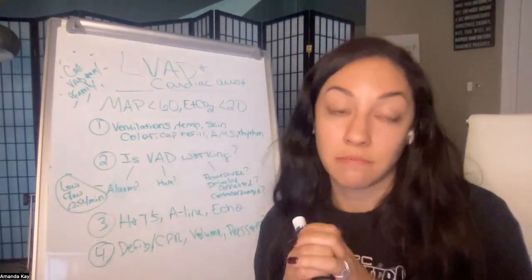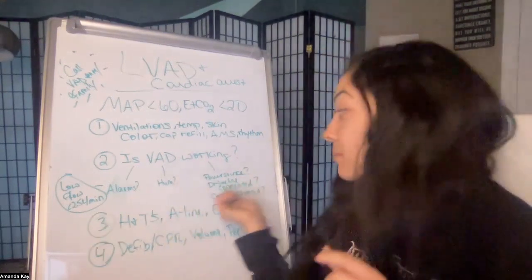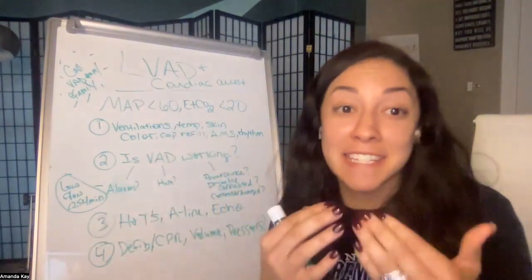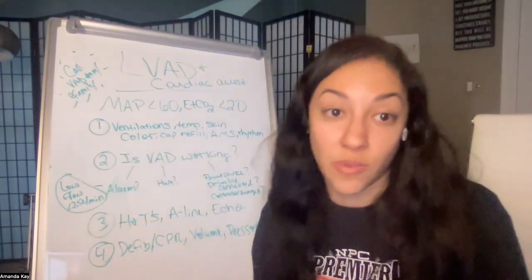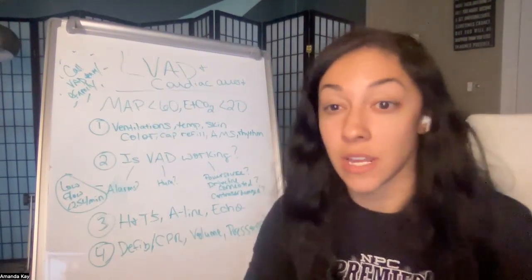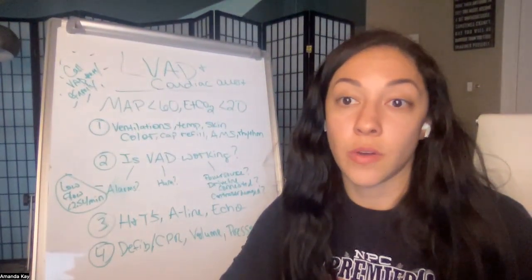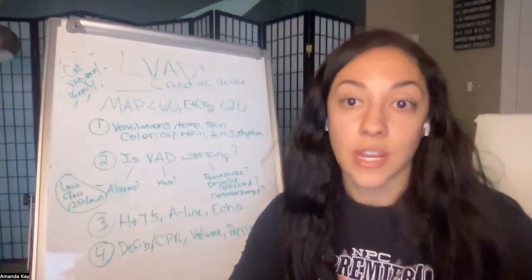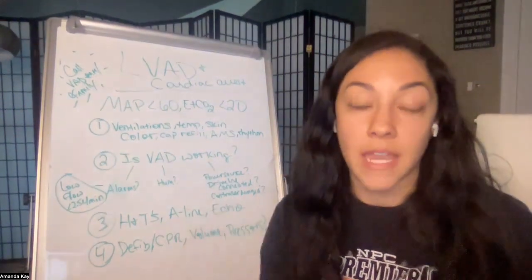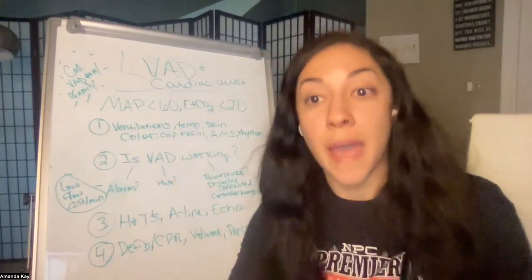I mean, the main thing is getting your LVAD team in, getting them on ECMO or something like that. But being able to do a TEE or something, even just something to see the chambers, what the heck is going on inside, is crucial if you can possibly do that, depending on the severity of the situation. And then there's a lot of controversy about chest compressions because they can cause dislodgement of the device, or they can cause aorta back to LV regurgitation, like it goes backwards.